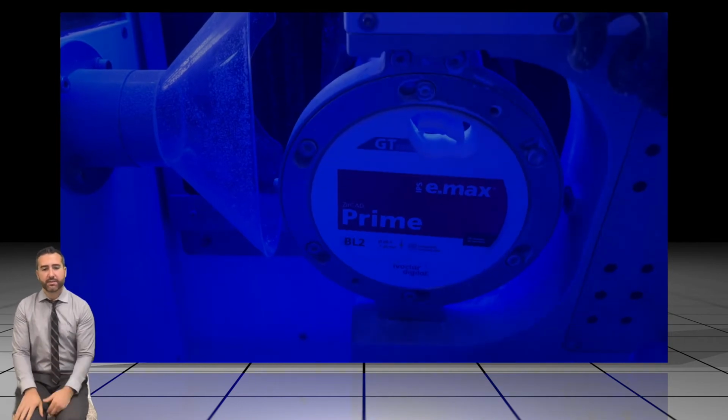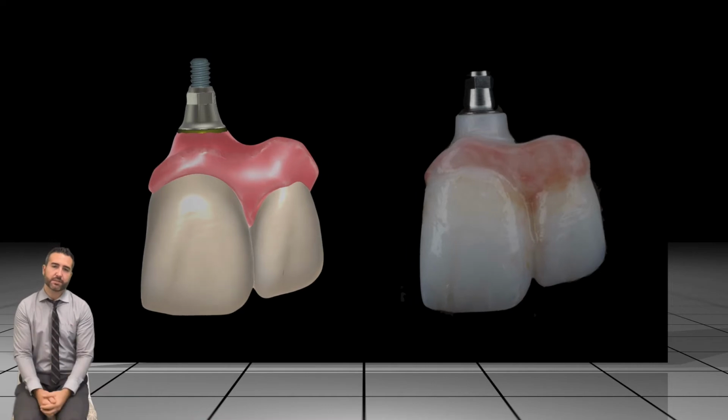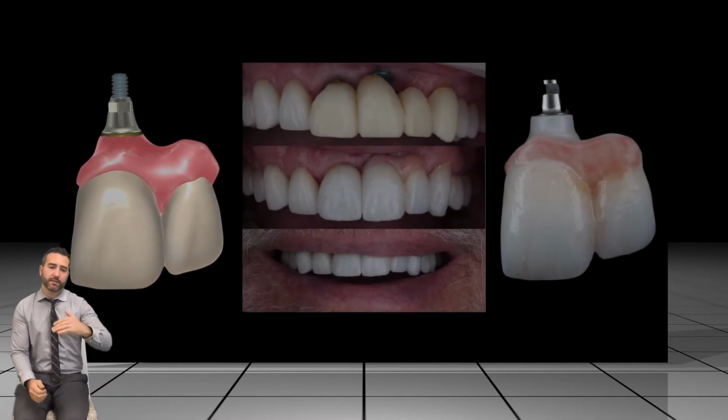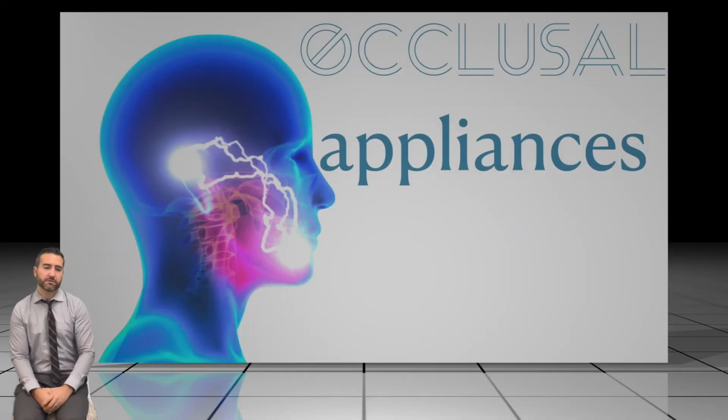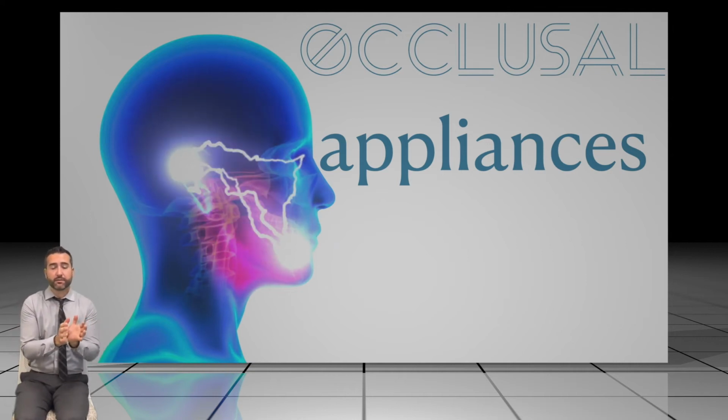And so here we could see milling this on the 50S puck mill, and we go from design to reality, and we're able to basically just screw this in for our patient and take them from something that's not so nice to something that blends in. And thank goodness for low smile lines in that instance. And it's not just prosthetics that we could mill.